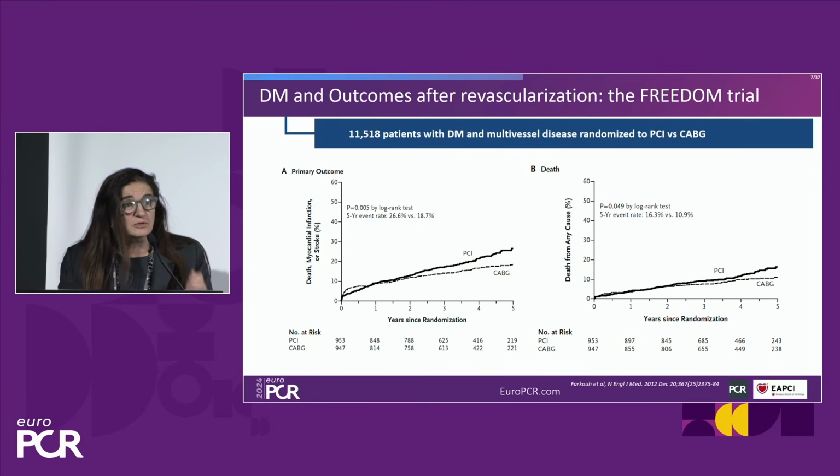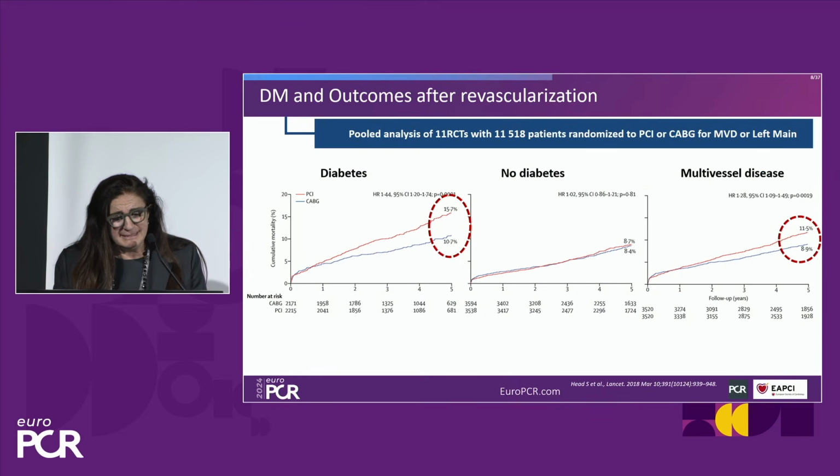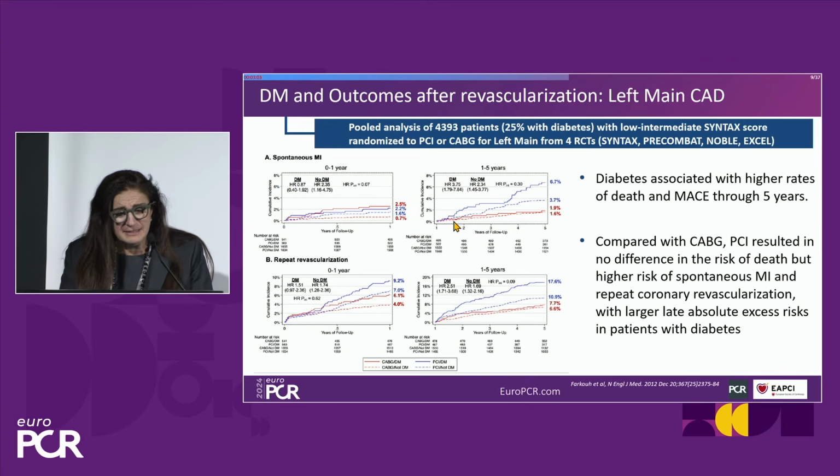When we look at revascularization in terms of what we're doing with our stents, FREEDOM was with the first generation drug-eluting stents, but you could see, just forget about revascularization. We know that the first generation drug-eluting stents are worse for revascularization, but death, MI, and stroke at 1 year was at 10% for diabetic patients with multivessel disease. And these outcomes, when you see, are mostly driven by diabetes. It's really the diabetic patients who are doing worse with our revascularization, especially with multivessel disease.